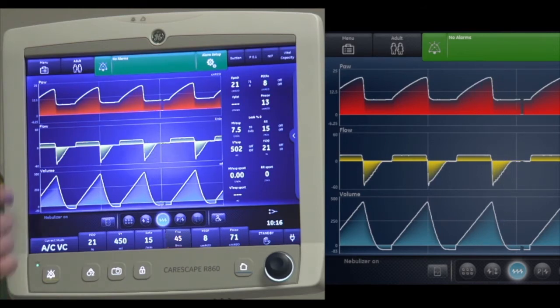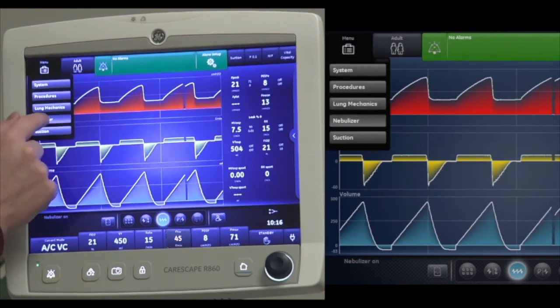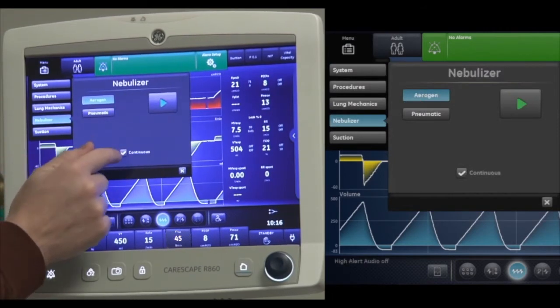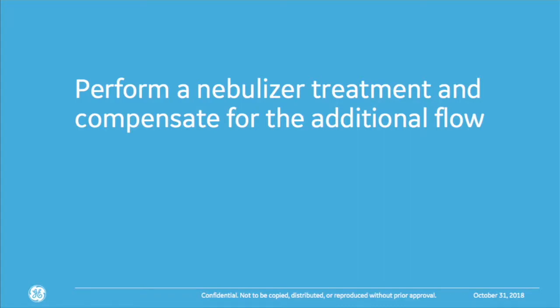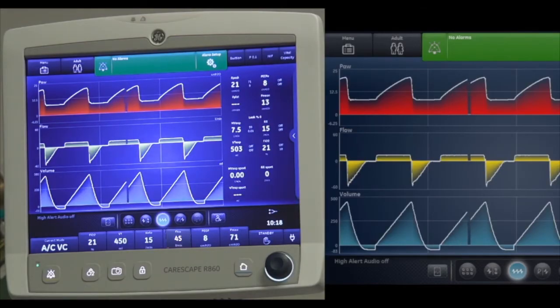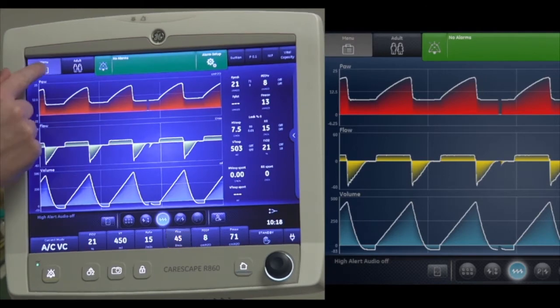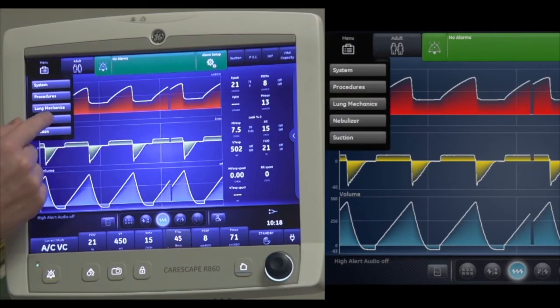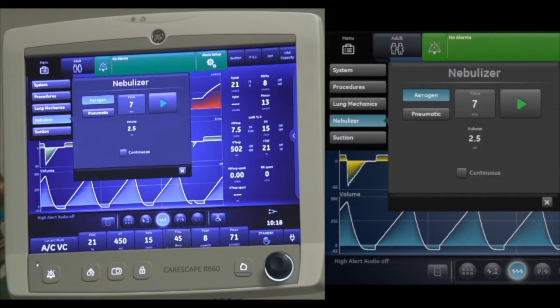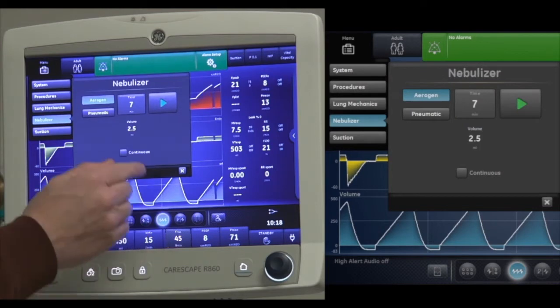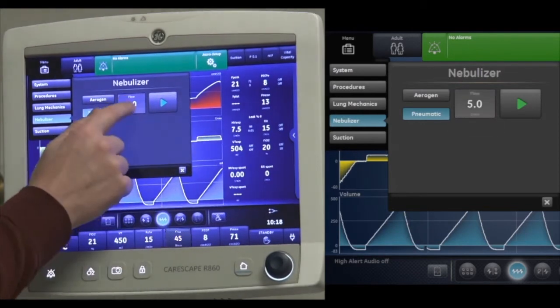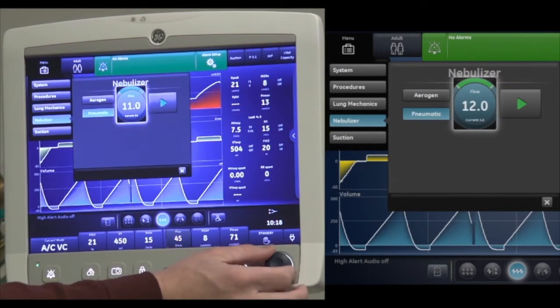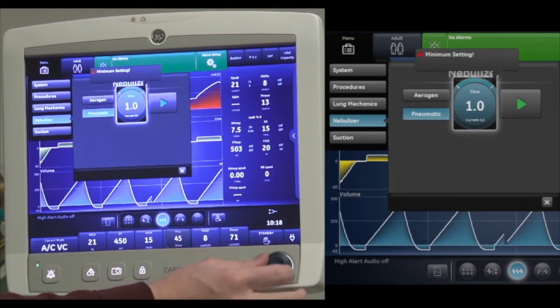In continuous mode, it doesn't show a time window because you have to physically go back and stop the treatment. If using an external pneumatic source for your breathing treatment, select the menu under nebulizer and select pneumatic. This will allow you to compensate for the additional flow in the circuit. You can match the flow rate to your external source, going up to 12 liters per minute or down to one.